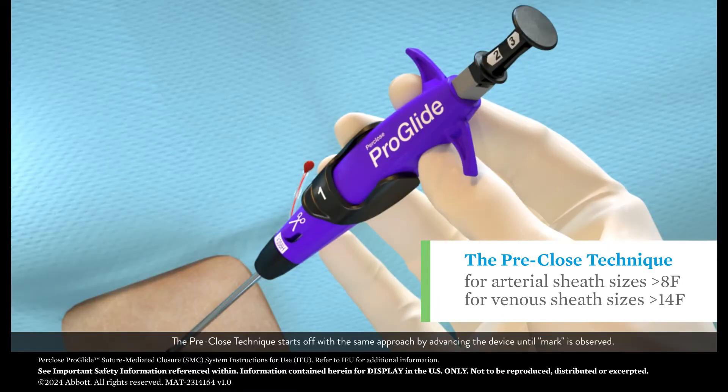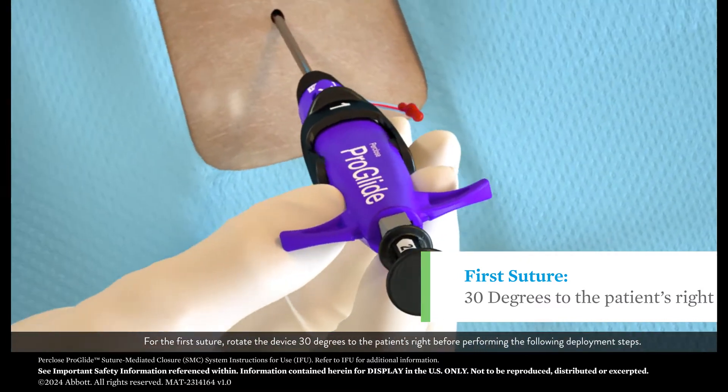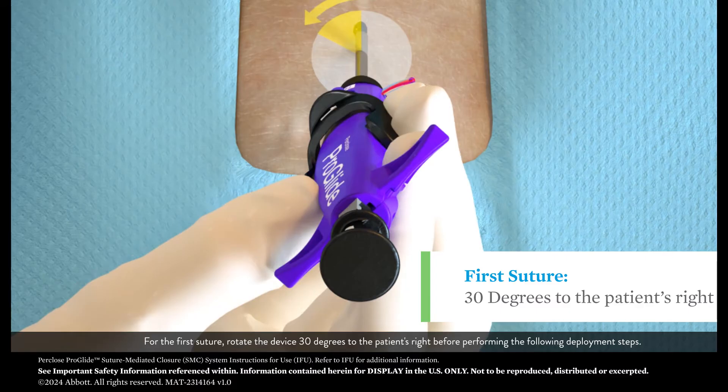The pre-close technique starts off with the same approach by advancing the device until mark is observed. For the first suture, rotate the device 30 degrees to the patient's right before performing the following deployment steps.